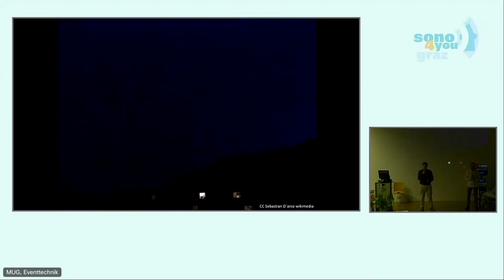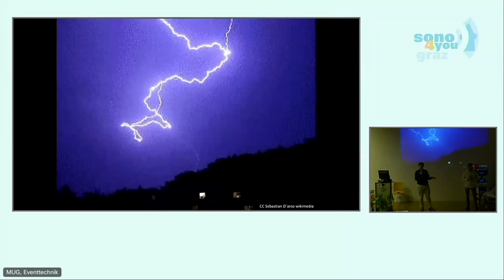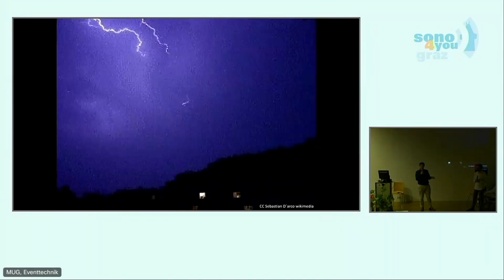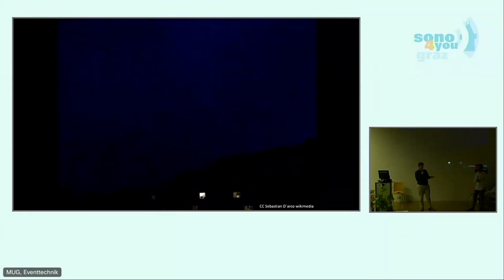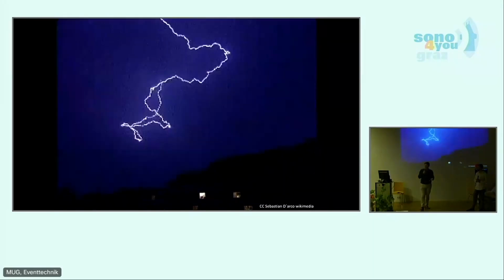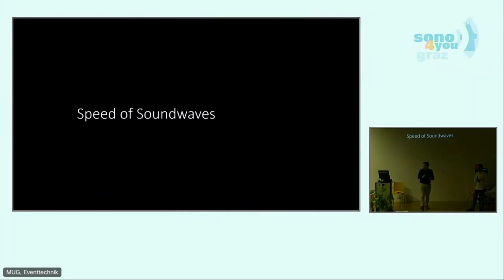But we can do the same thing as bats can do. Just imagine a thunderstorm and you want to know how far away it is. What do you do? Right, you just count the seconds after you see the lightning and then divide it by 3, and you know how many kilometers away the thunderstorm is. Exactly that is what an ultrasound machine is doing. It's just counting the seconds. Or the milliseconds.